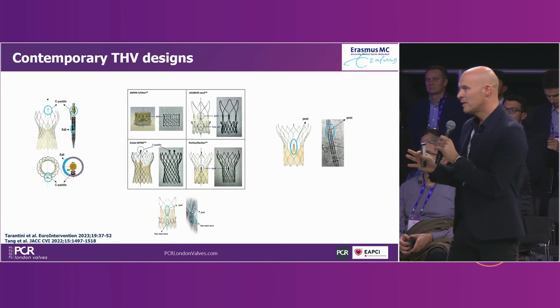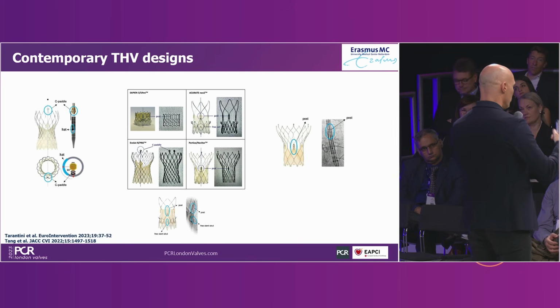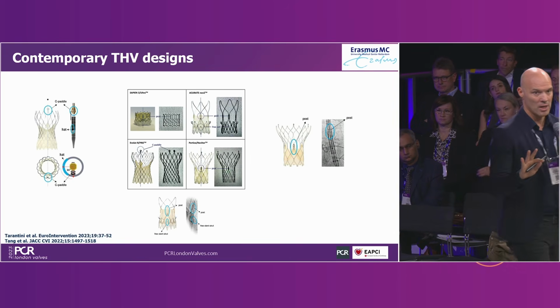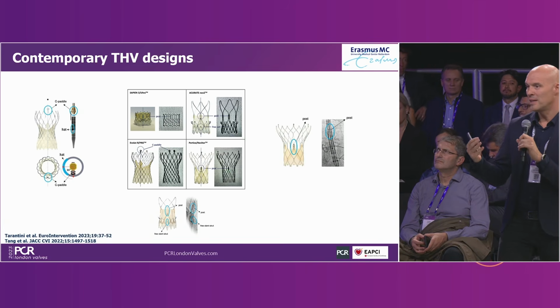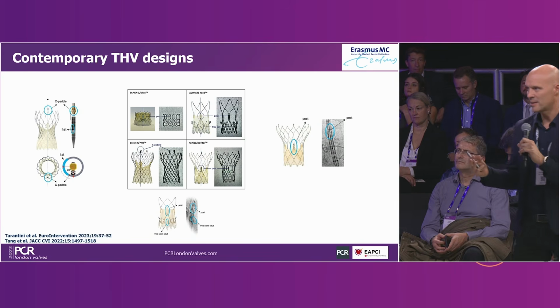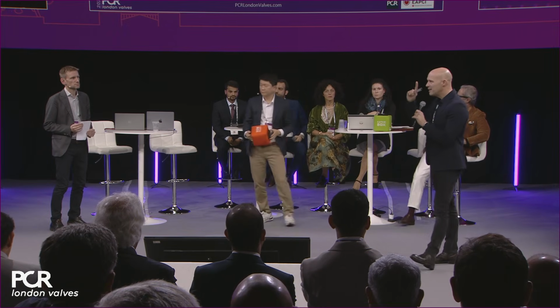But what I feel helps very much is that you as an operator are able to do your CT analyses yourself. I don't outsource my CT evaluations. I do them myself, because that really helps me to appreciate all the potential issues that I can encounter. But from the get-go, I take into consideration I may need to re-access the coronaries at one point.